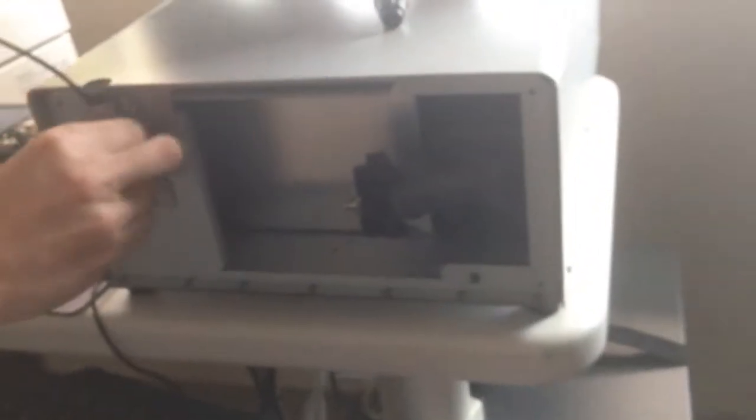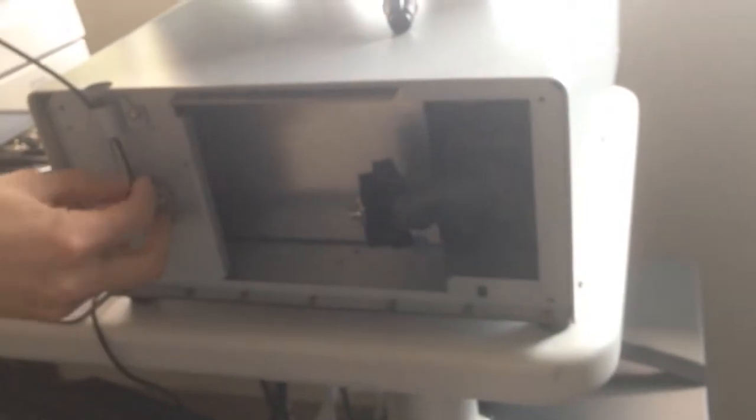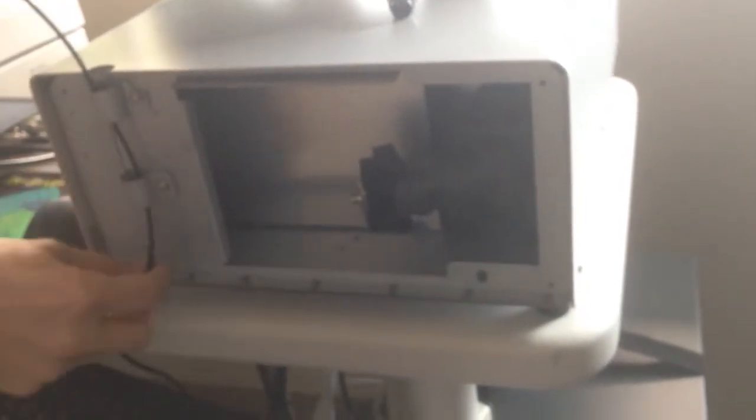I'm going to run it through here. Be very careful with it. You don't want to crimp it. You don't want to pinch it.